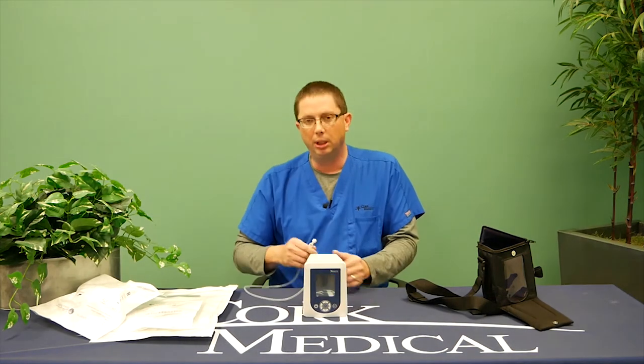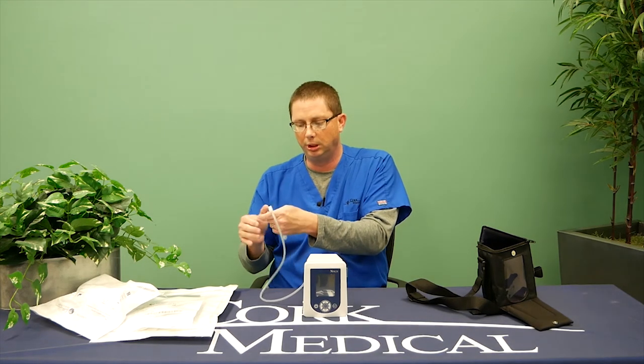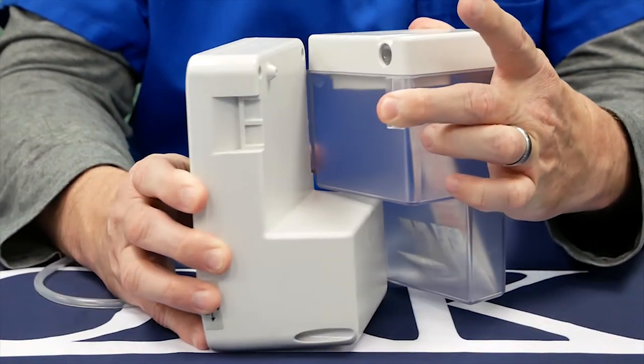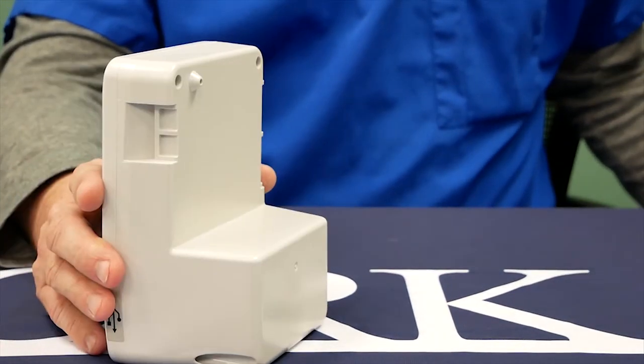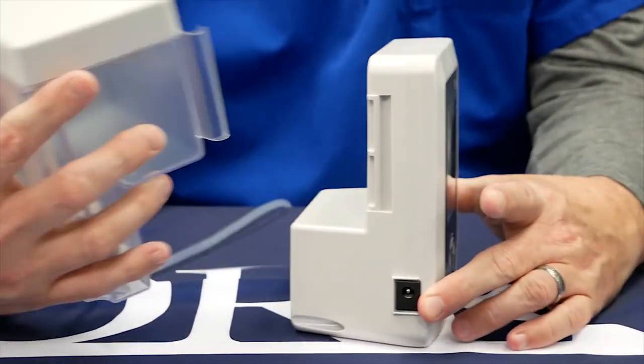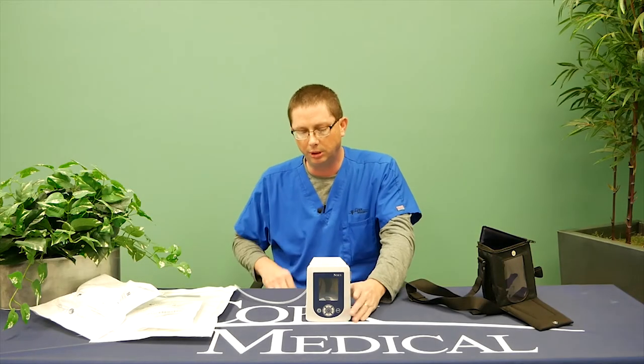One of the responsibilities as a patient is you will have to change this canister if you receive a canister full alarm, meaning the canister is filled with drainage. On the screen, instructions will pop up. The first thing it says is power off your pump. Next, you'll have a clamp on the canister — clamp that. Remove your canister and dispose of it in a trash bin. Take your new canister out of the packaging, place it on your pump, lock it in place, unclamp your tubing, then power on your pump and your therapy will resume.